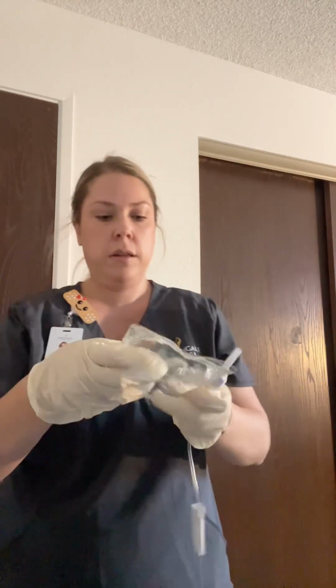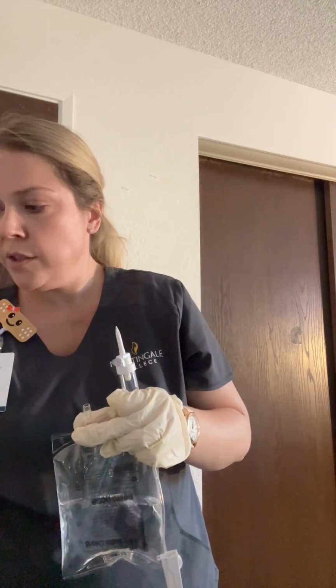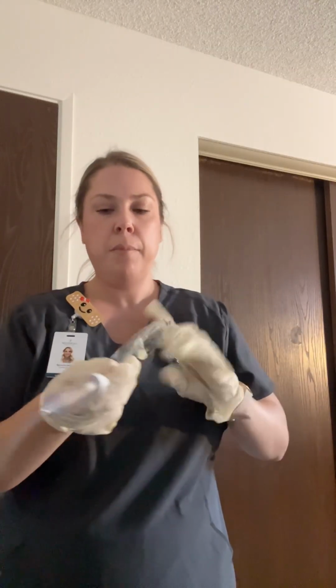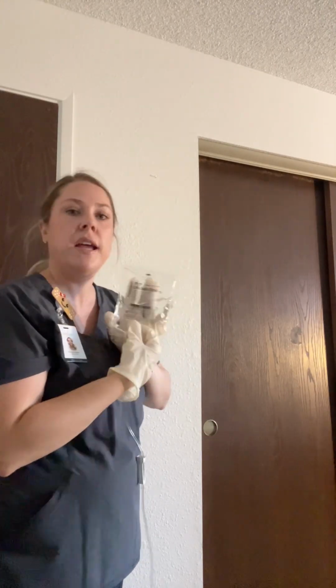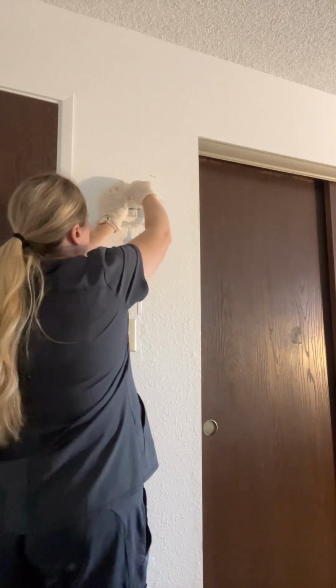So now we are going to grab our fluid, remove the cap on the spike, and spike our bag. Again, making sure our roller clamp is shut so that the fluid doesn't go rushing out. Also want to make sure our tubing is not all tangled up. We want to hang the fluid up and make sure the IV container is at least 30 inches above our IV site in adults. So we're going to go ahead and hang that up.